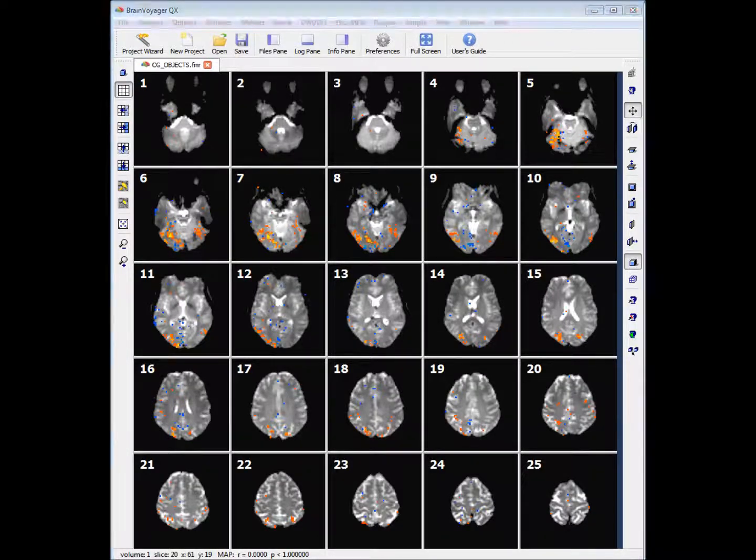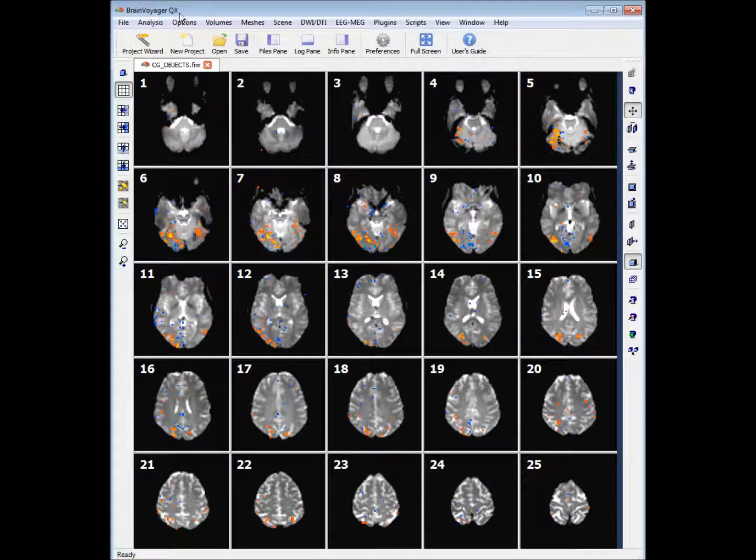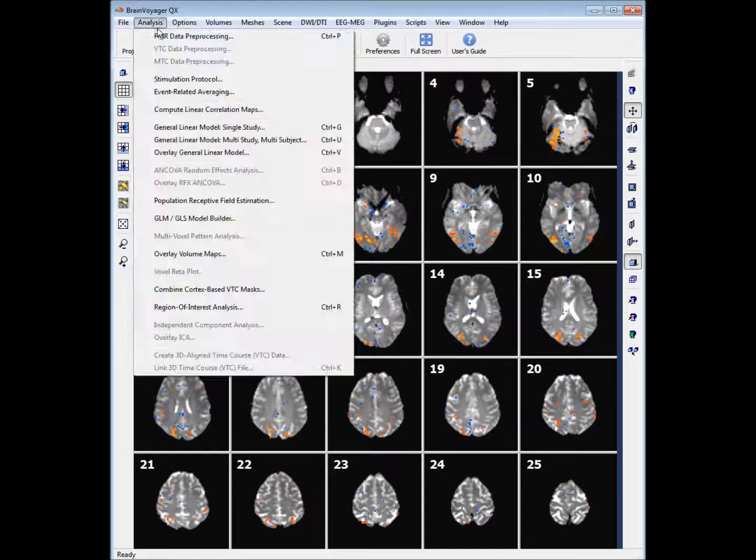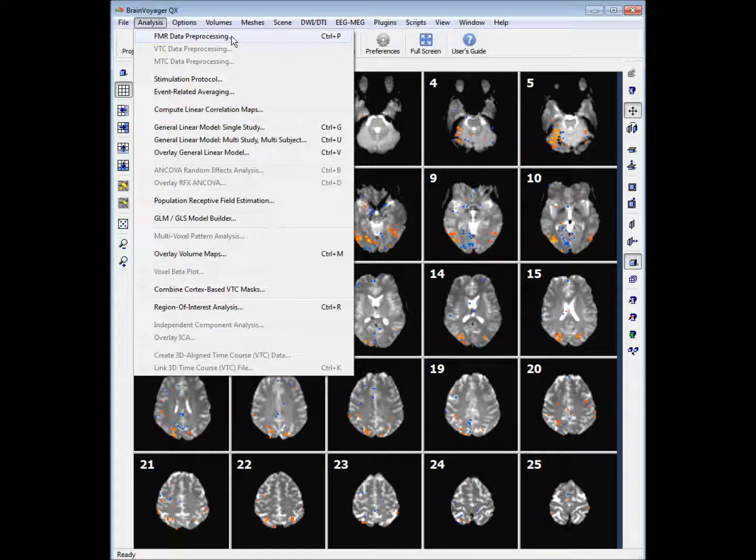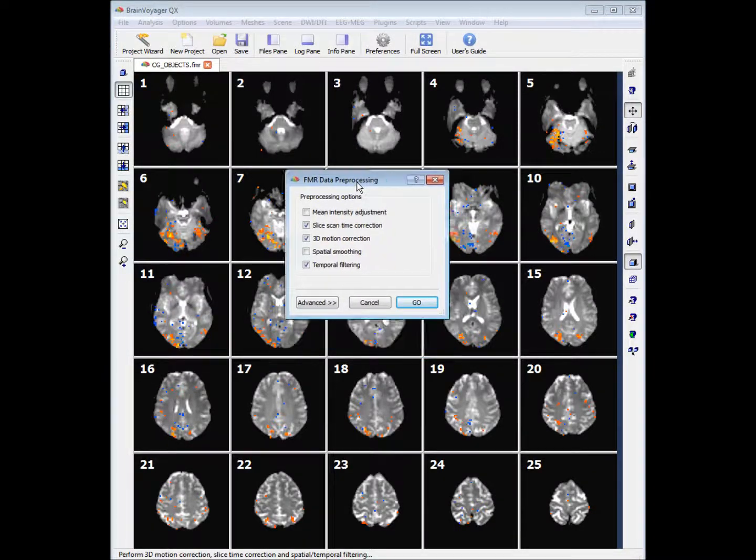So now that we've done some basic statistics, we want to go on to do some proper statistics, but before we can do that we want to pre-process our file. So we click on Analysis and click on FMR data pre-processing.